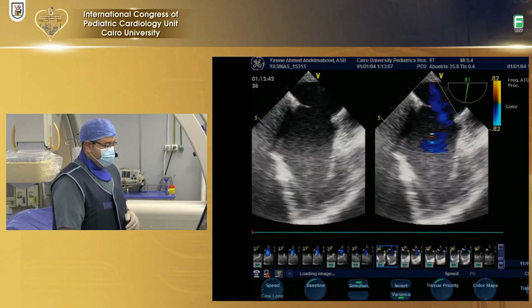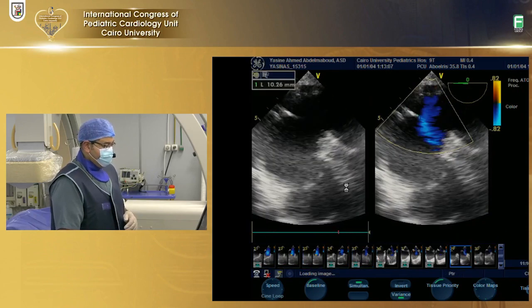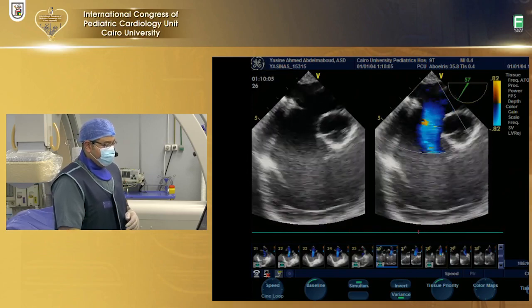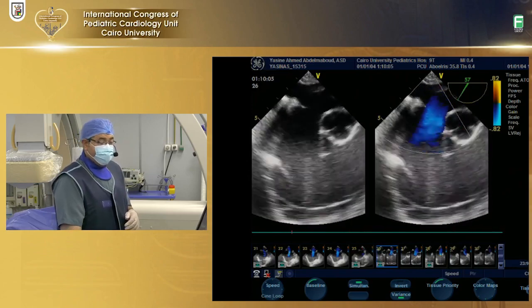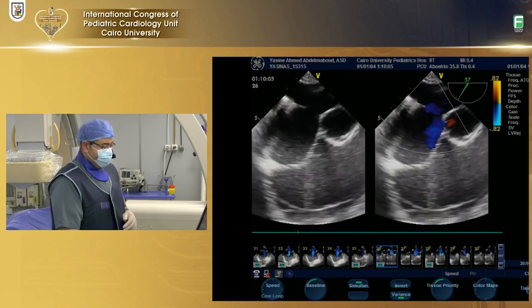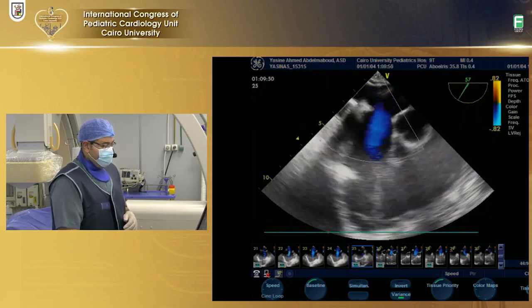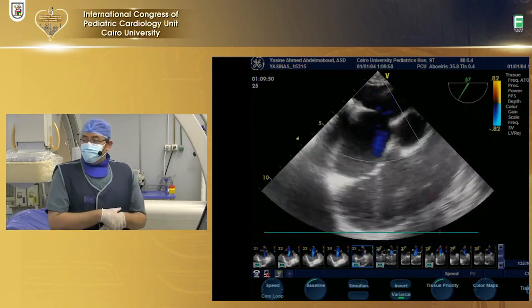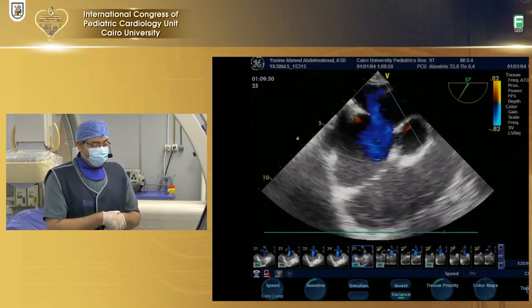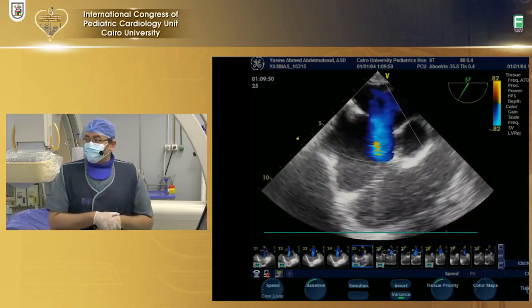Then we'll go to the short axis to show the aorta. Here, in the short axis, as we see, there is no rim, no retroaortic rim. Actually, it's a bald aorta. So you think, Dr. Osama, it is an oval defect rather than a round defect? Yeah. And actually, it's a large defect with dimensions of like 20 by 30 millimeter. Okay. Thank you, Dr. Osama.